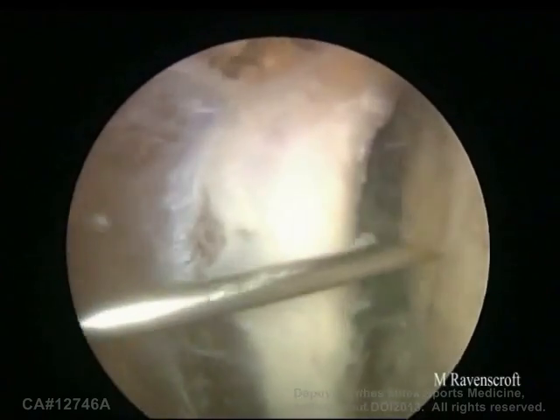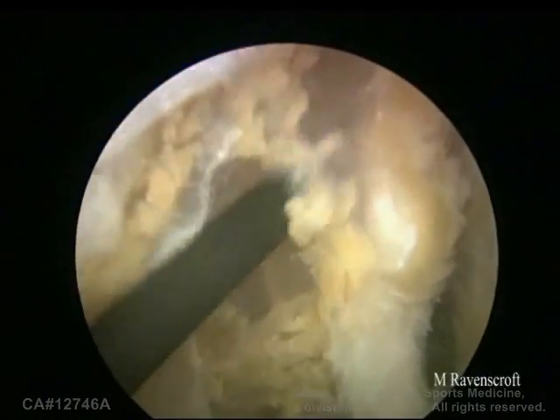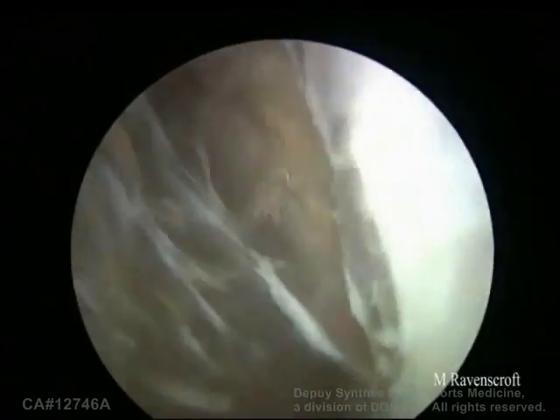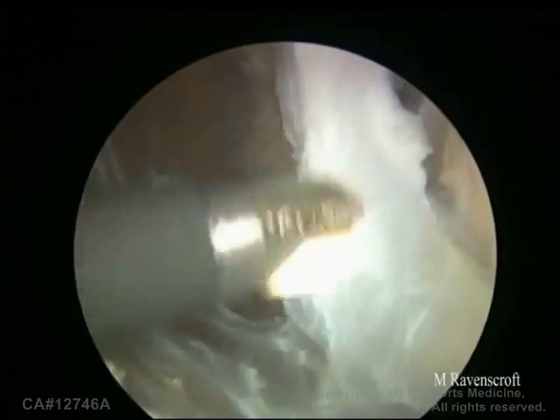This is the J port and this is the port we'll be using to do the subscap split. You need a good angle with the spinal needle to create the subscap split. So now we're still viewing through the D port and using the vapor through the J port to clear anterior to the conjoint tendon, to start to look for the pec minor tendon. And you should be able to strip all the way down until you can see the top edge of the pectoralis major muscle and its tendon coming across around the side of the conjoint tendon.